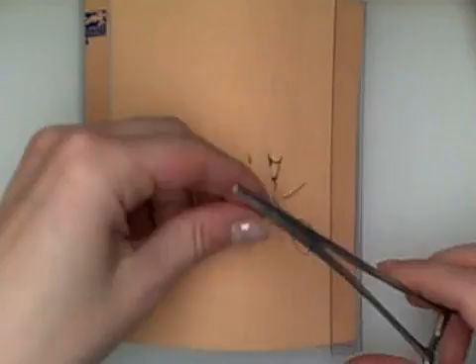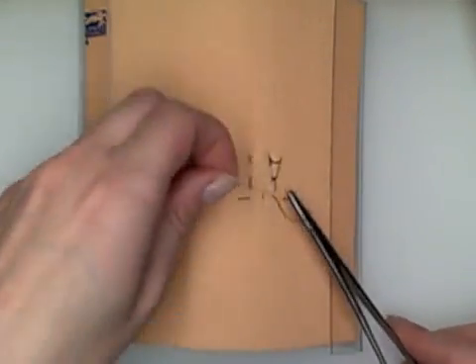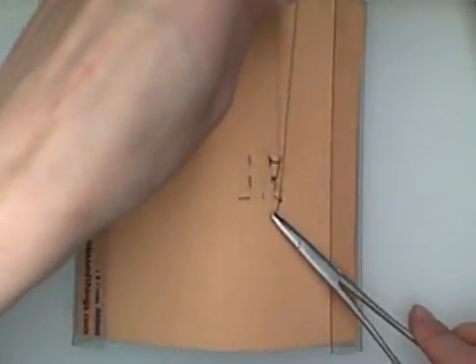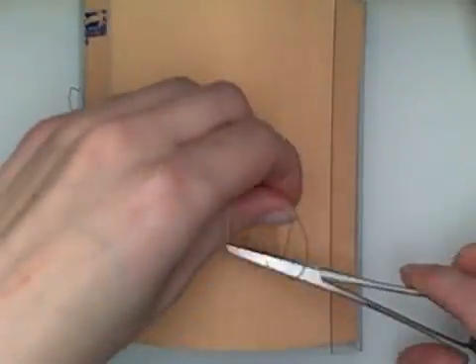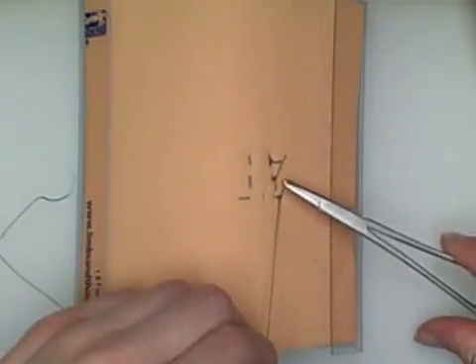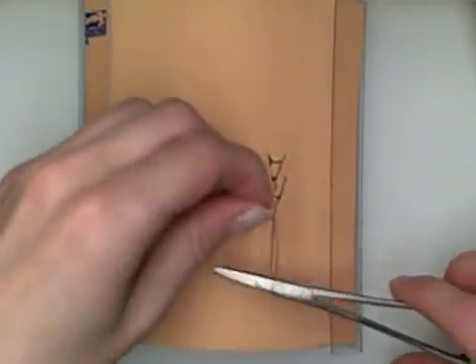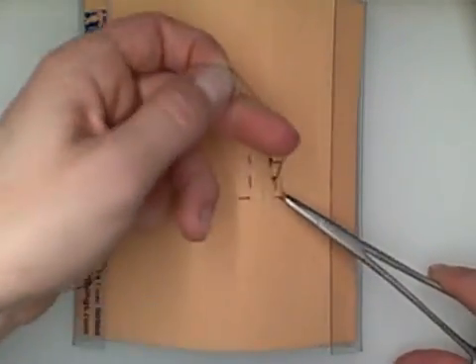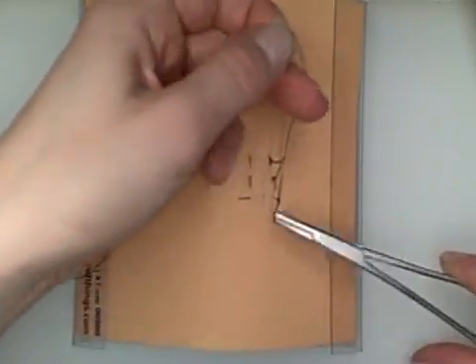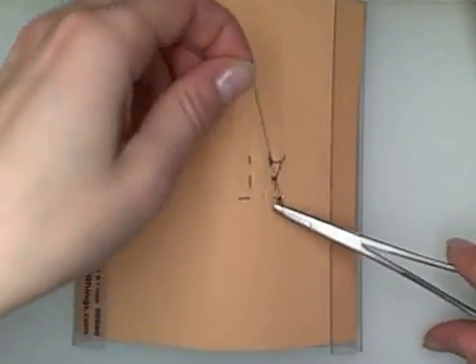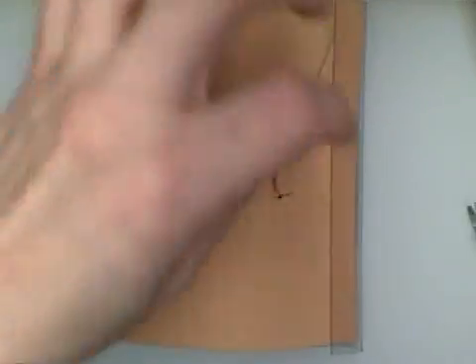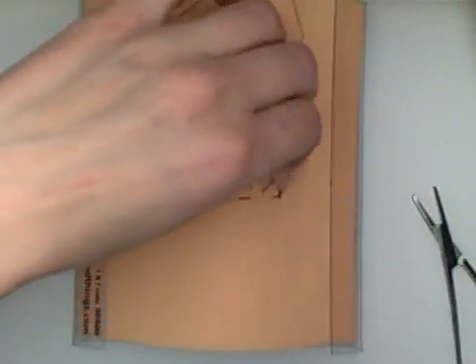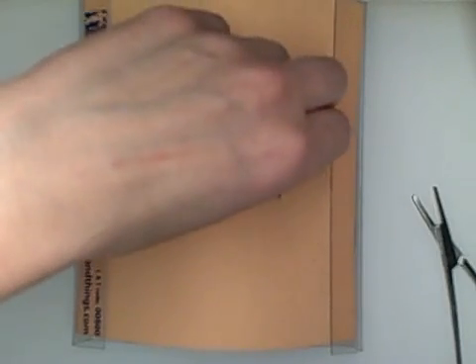Okay, so now I'm going to do an instrument tie. Now, I did not leave much of a tail for myself, so I don't have too much to cut here.